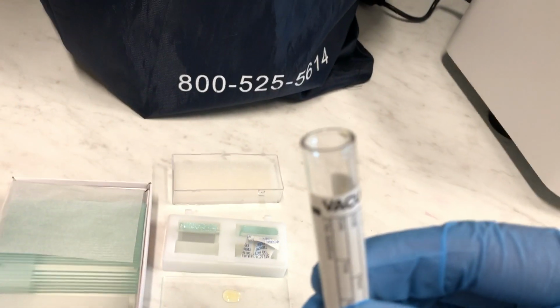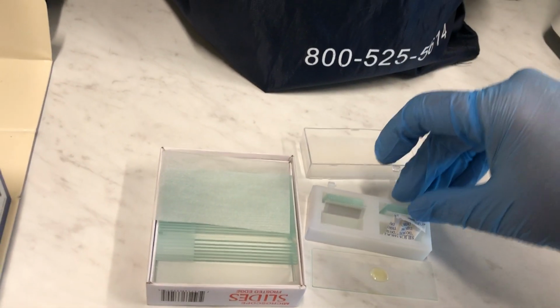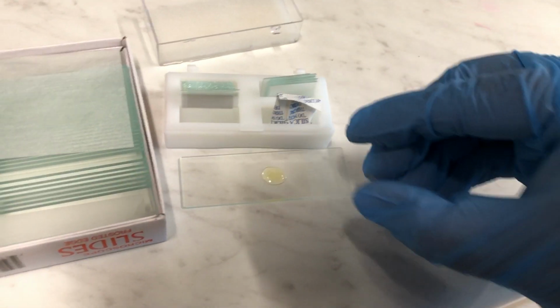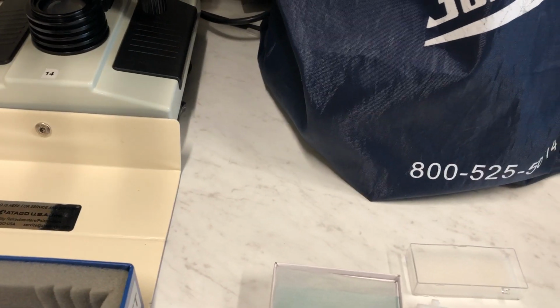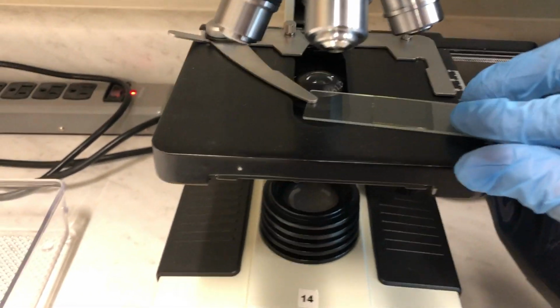And then you can recap this because there's still more sediment in there that we could use later if we wanted to add stain to it. So then the last thing is take a cover slip and place it right over the urine. And now this is ready to be viewed in the microscope.